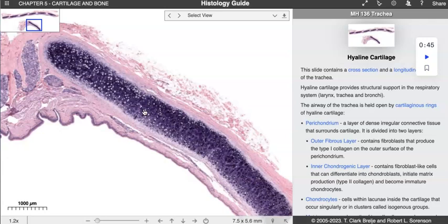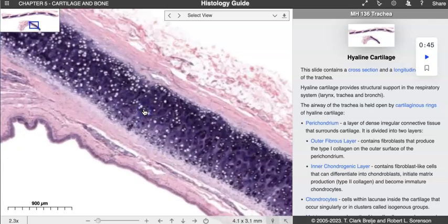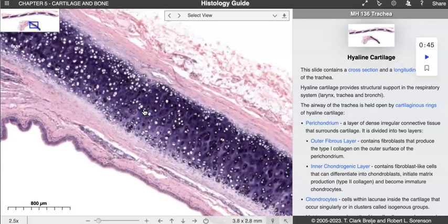There is still protein fiber in this matrix, but we don't necessarily always stain to see that. As we're getting closer and closer, again, that watercolor background is really kind of apparent, right? On your slide, this might be more of a lighter purple, not maybe so intense as we see here. You have these very large white dots everywhere, which are really telling us that these are where the cells would be located that actually made all of this lovely cartilage tissue.